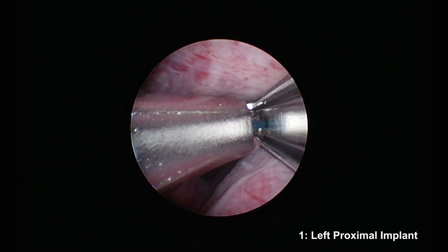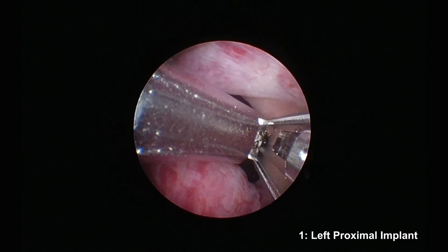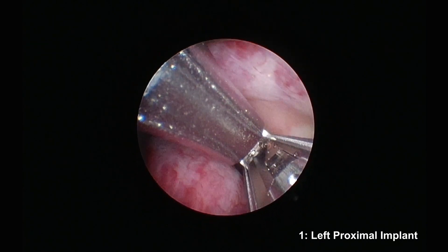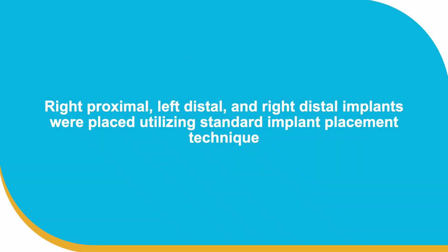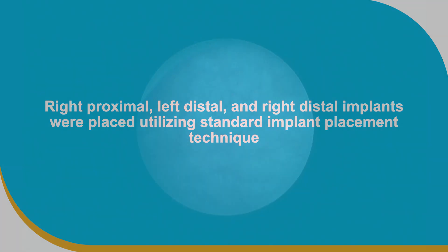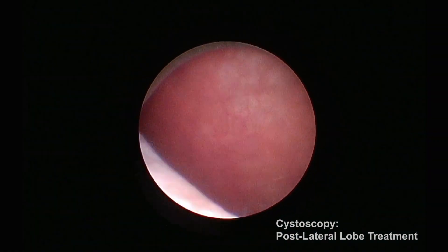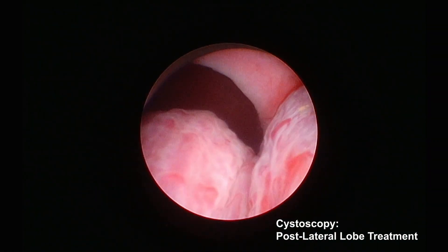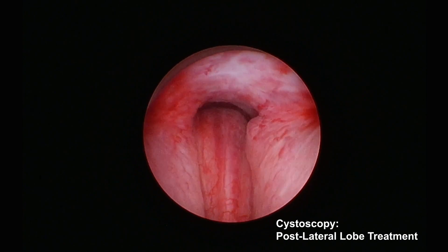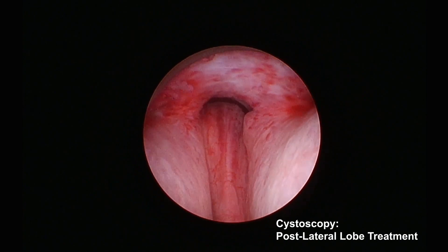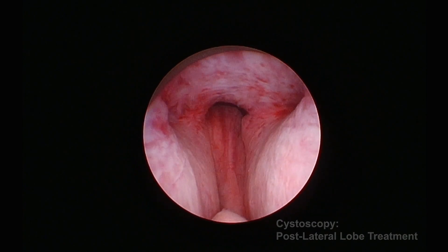I carefully pass over the bladder neck and OML tissue to minimize mucosal contact and maintain visualization. The right proximal and both distal implants are placed utilizing the standard implant technique, for a total of 4 lateral lobe implants. Using the UL-2 with an inserted scope seal, I visually assess the placed implants. I see that, though we have created an anterior channel, the OML remains obstructive.